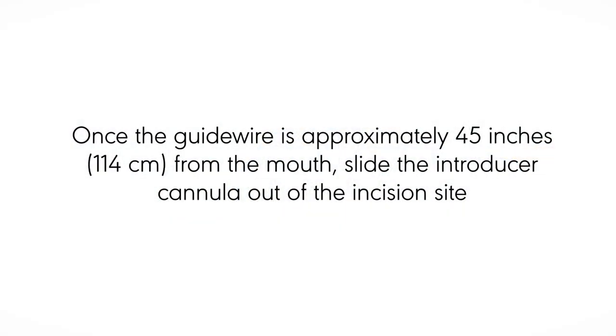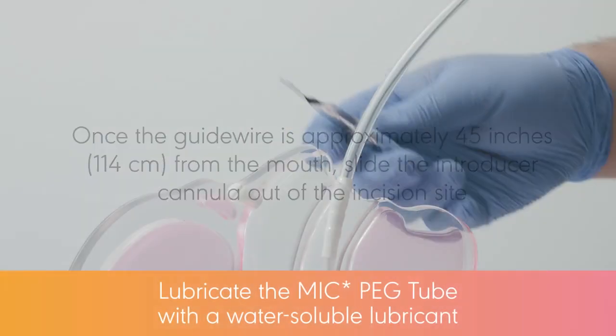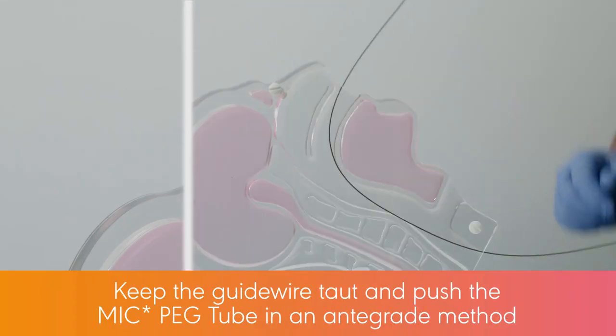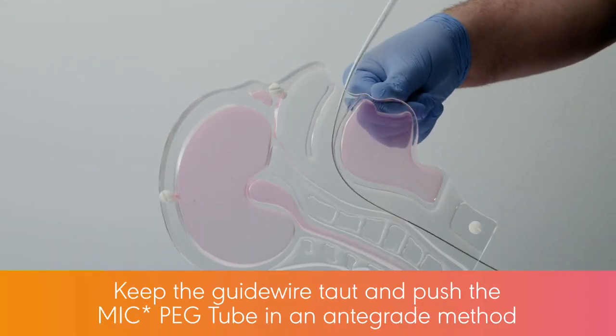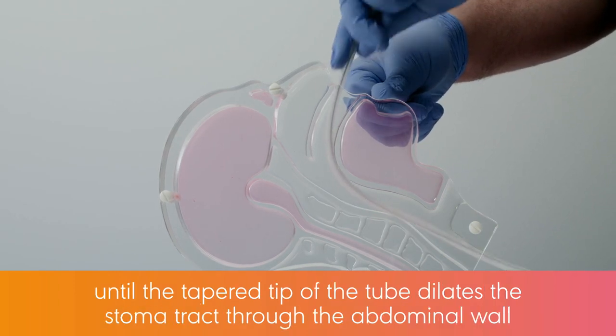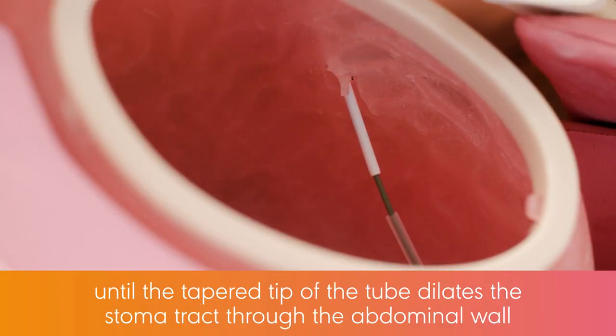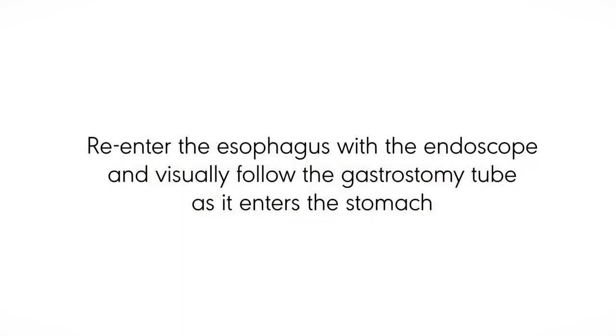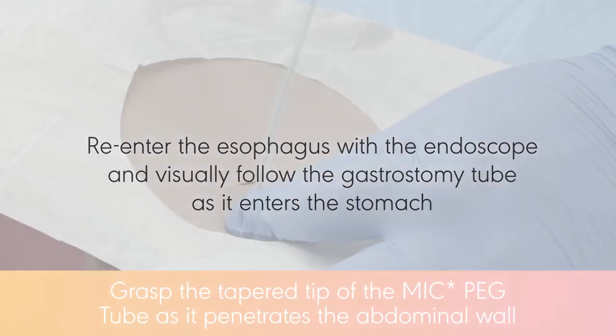Once the guide wire is approximately 45 inches or 114 centimeters from the mouth, slide the introducer cannula out of the incision site. Lubricate the MIC-PEG tube with a water-soluble lubricant. Keep the guide wire taut and push the MIC-PEG tube in an antegrade method until the tapered tip of the tube dilates the stoma tract through the abdominal wall. Re-enter the esophagus with the endoscope and visually follow the gastrostomy tube as it enters the stomach.